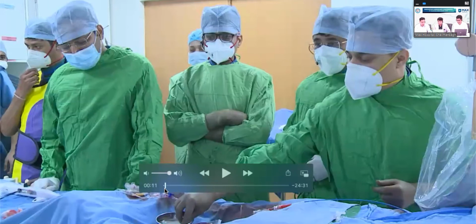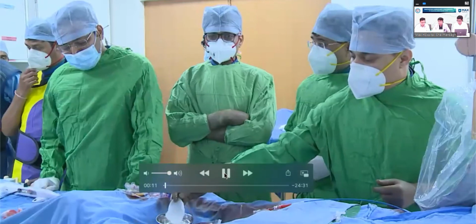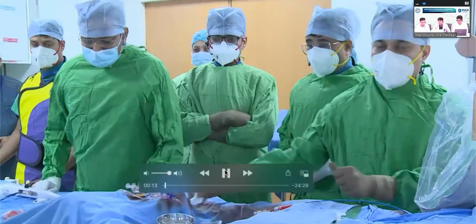This case in the box is basically a lesion with high calcium content. As we all know, high calcium content lesions are complex to treat by percutaneous technique because of the increased risk of incomplete lesion preparation and suboptimal stent deployment. So there may be a higher chance of acute and chronic failure. So this is the case of a calcified LAD lesion, case in the box. This is a recorded case.